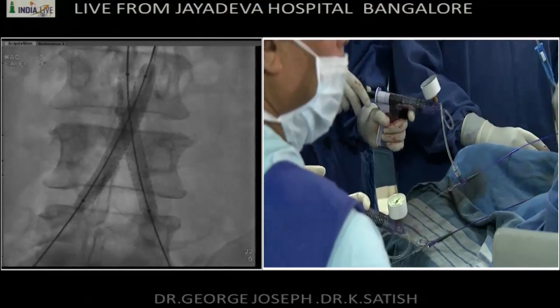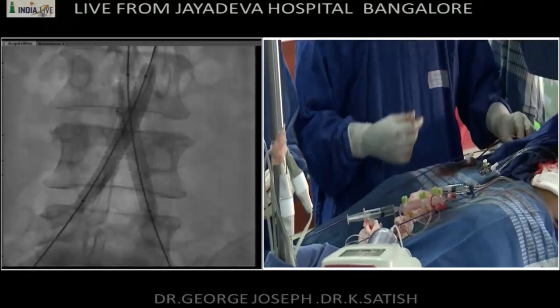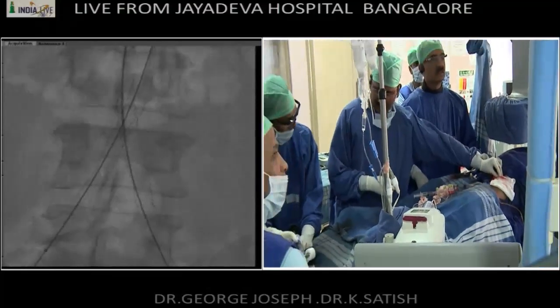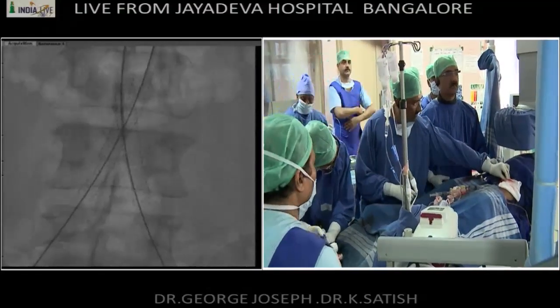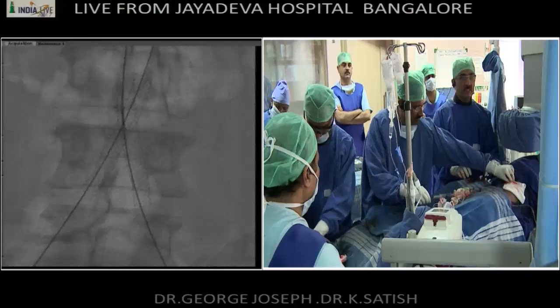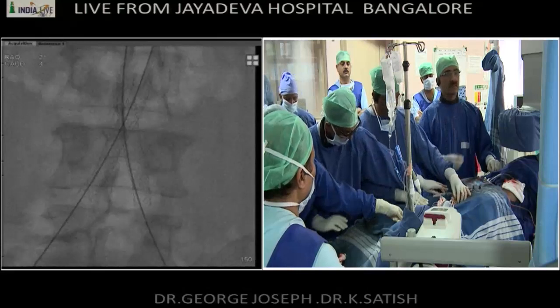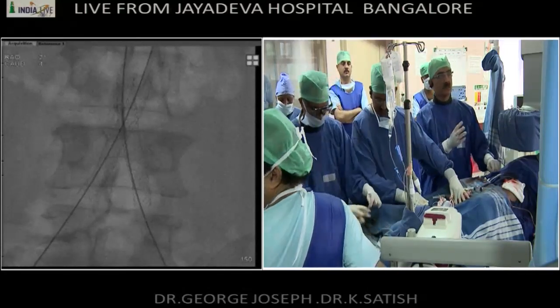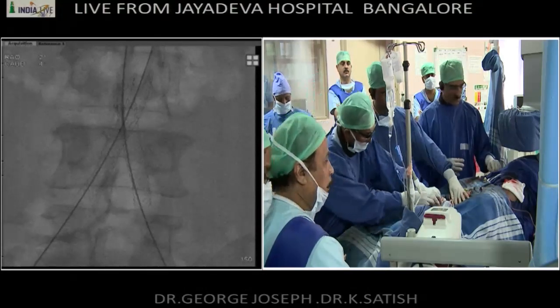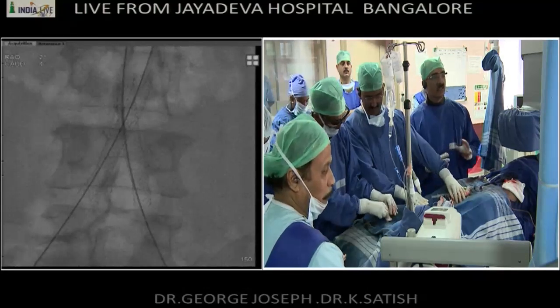All right, so now let's take the balloons out. Now we'll have to see whether extensions are required on either side. This could be either balloon expandable or self-expanding. Because we may be coming into the external iliac, self-expanding may be better because it will conform to a larger diameter proximally and smaller diameter distally. External iliacs are notorious for rupture. So I don't like dilating them beyond 6 millimeters.